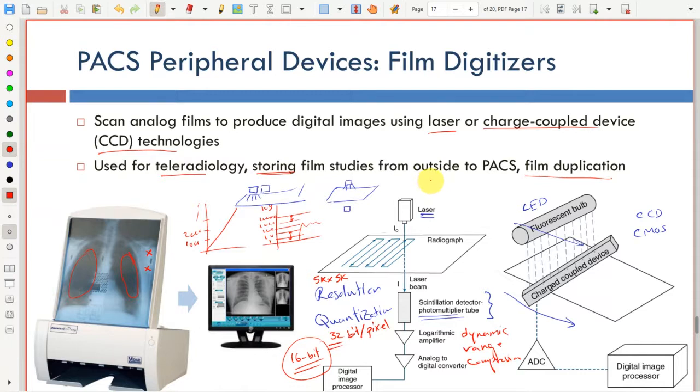And unfortunately, this other place doesn't have PACS, and doesn't output the studies that you do there into a digital form. They actually provide films to the patient, but you still want to have these films added to the patient record in your hospital, or it can also be sent to the referring radiologist or referring doctor, okay, along with the report. So you want to have it in a digital form so that you make things easier to exchange such information.